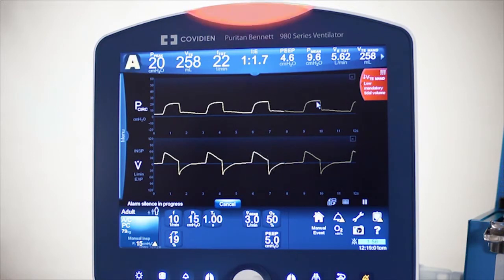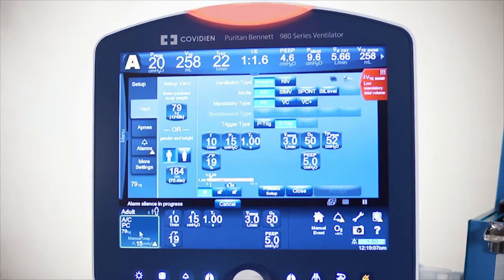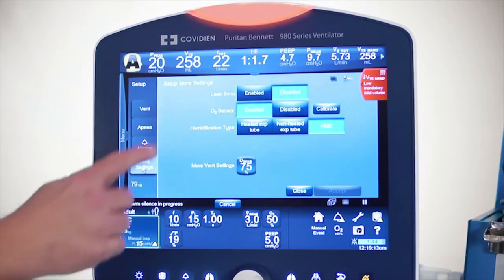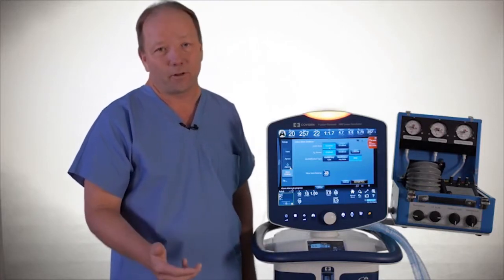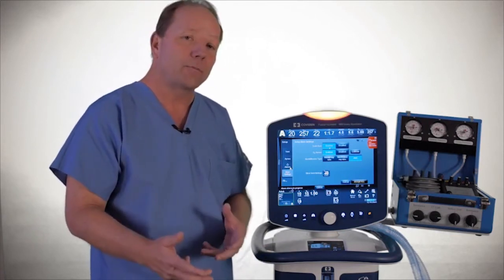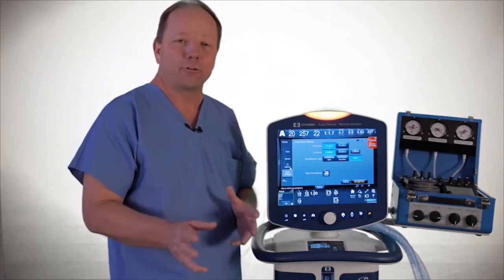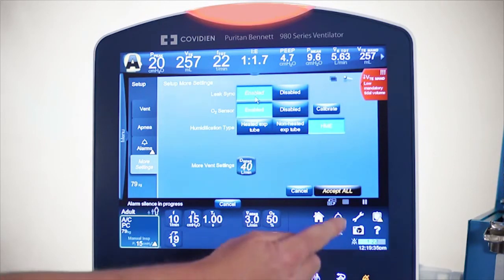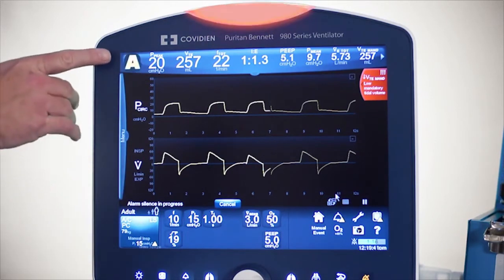This software is accessed through the Event Setup button. Notice I'm up to 22 breaths per minute. Under More Settings, we'll find the LeakSync software. You may be familiar with our previous software called Leak Compensation software — it is now called LeakSync software, and it also has the additional capability of working in volume control ventilation plus as well as volume support. Simply turn on the LeakSync software, enable it, and hit Accept All. As soon as that A turns to a C, it has captured the leak.